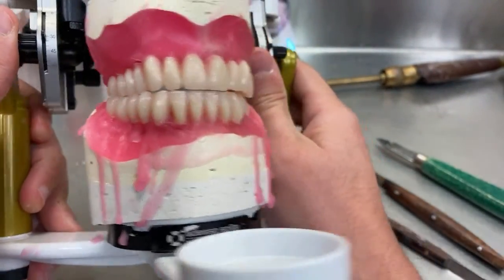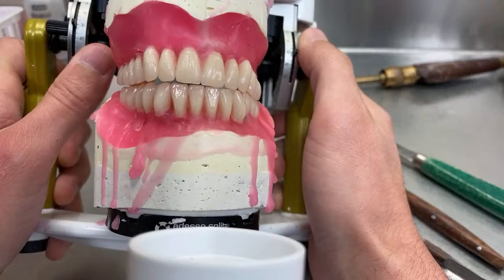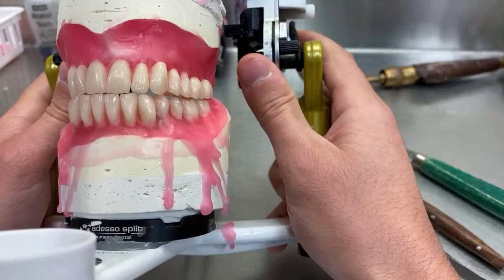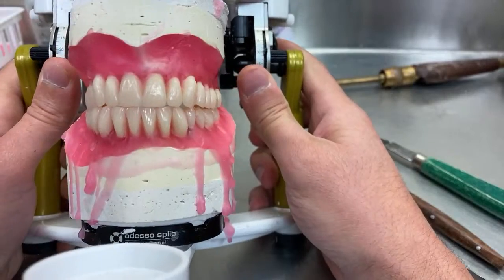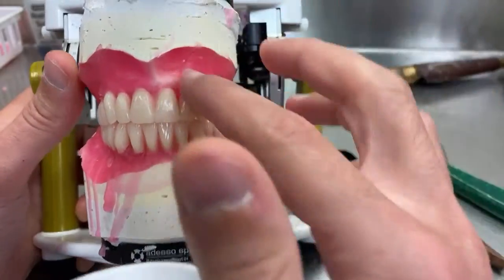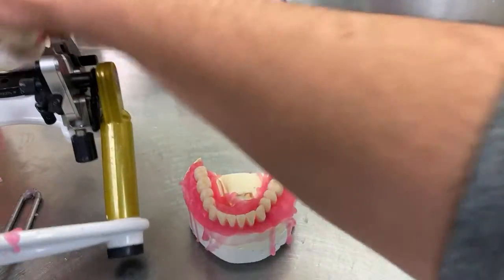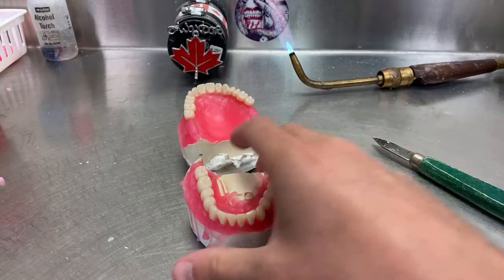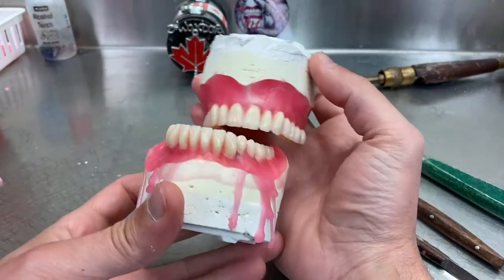I'll show you. It's close enough. And then a little to the side here, and then protrusion. So that would be really good if it was being processed, but right now it's all in wax and things could change. But I always like to set it that way, and if everything is good, then I don't have to do anything when it's processed or after it's processed. All right, which one do you prefer I start with, upper or lower?